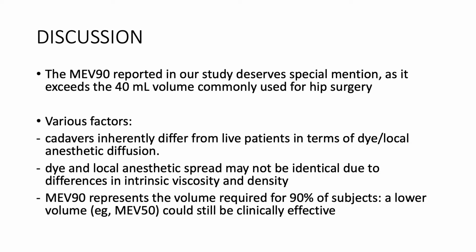Number one, cadavers inherently differ from live patients in terms of the diffusion of the dye or local anesthetic. And this dye and local anesthetic spread may not be identical due to differences in intrinsic viscosity and density. The minimum effective volume represents the volume required for 90% of subjects. Sometimes a lower volume, for example 50% of subjects, could still be clinically effective.